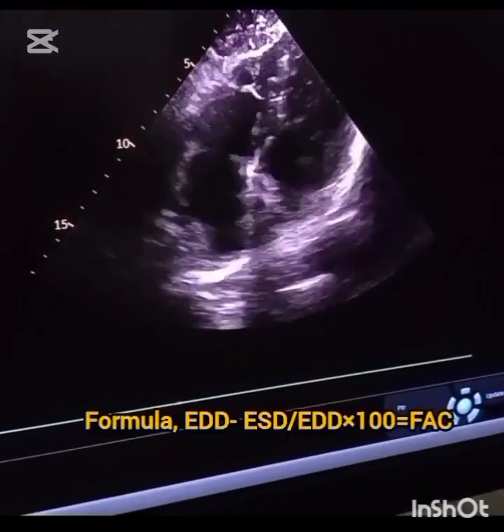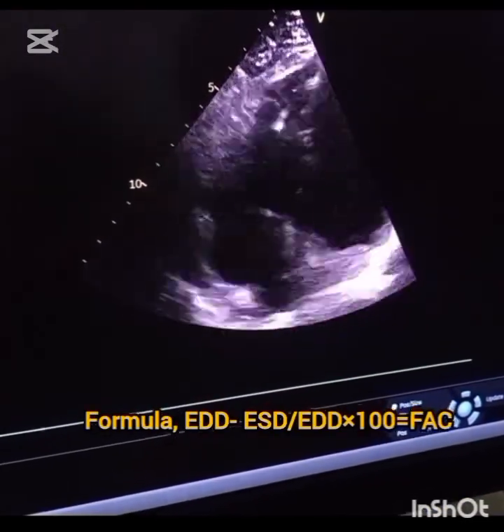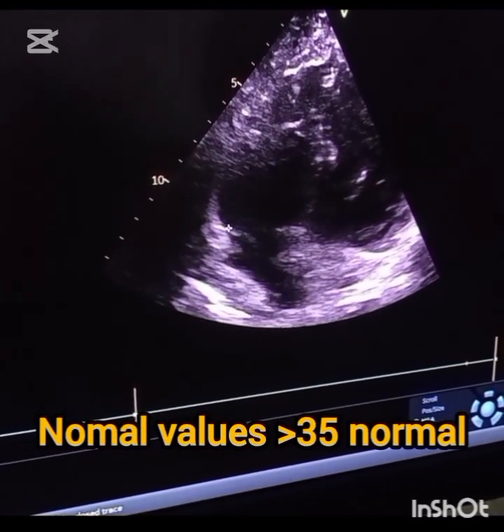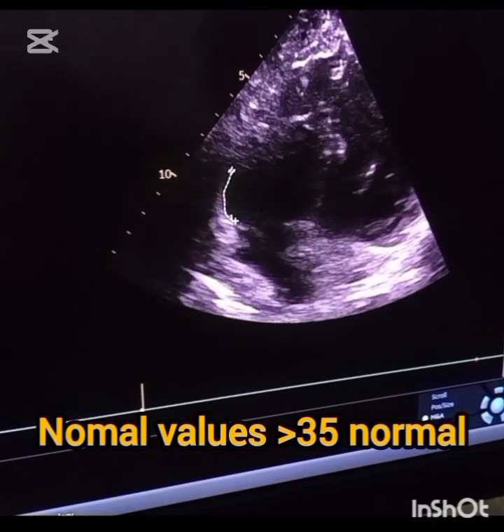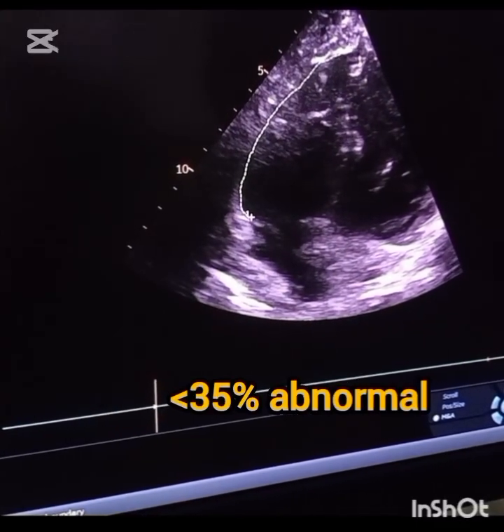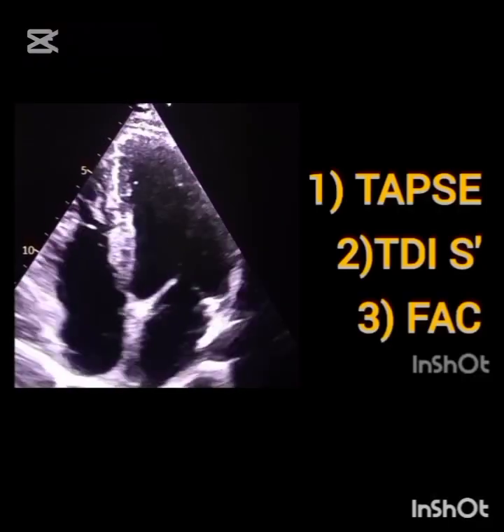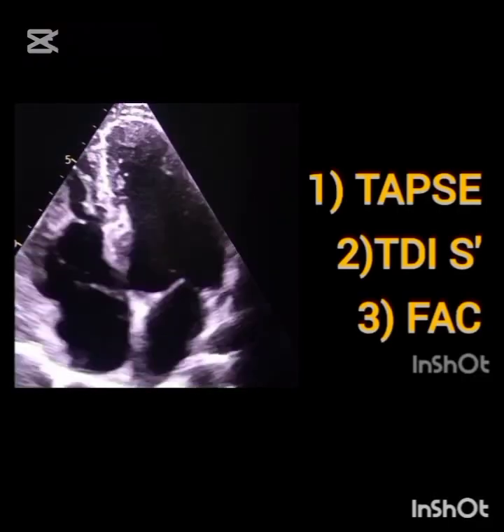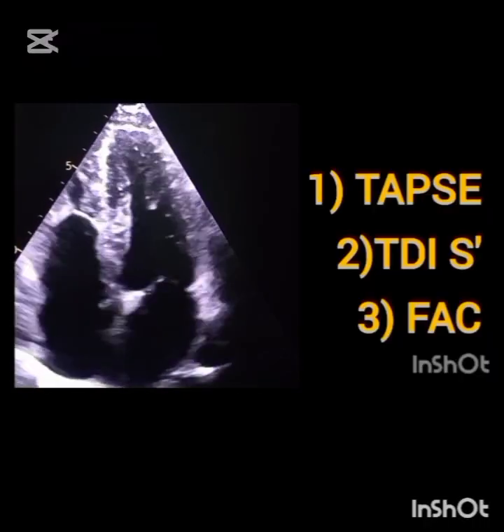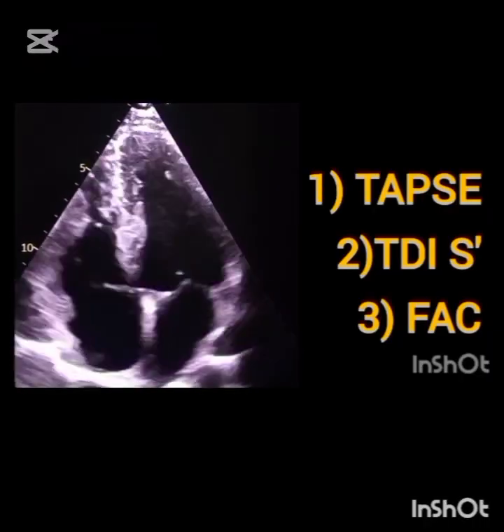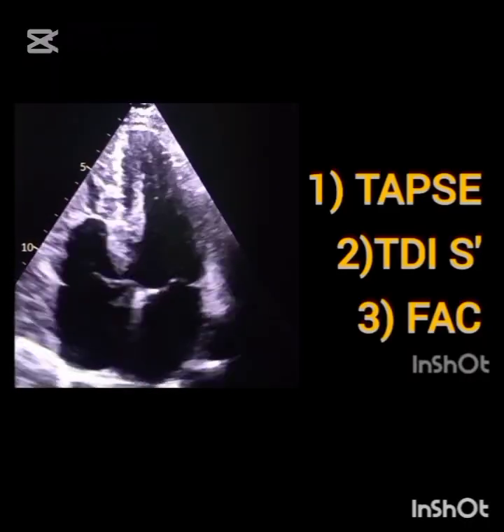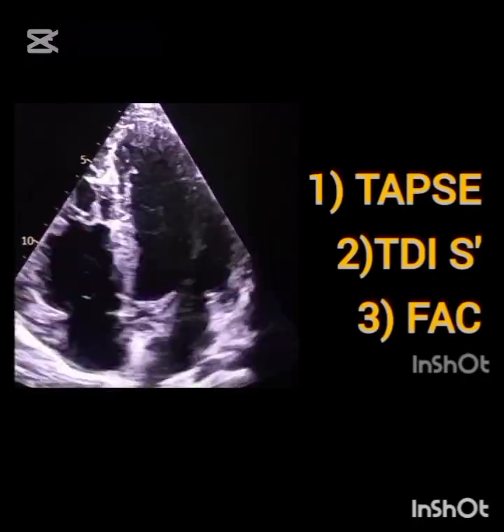The machine will automatically calculate the FAC, which here is 39%. If your machine doesn't calculate it automatically, use the formula manually. Greater than or equal to 35% fractional area change is normal. Less than 35% indicates right ventricle dysfunction. Right ventricle plays a vital role in overall cardiac performance, pulmonary circulation, and patient prognosis.